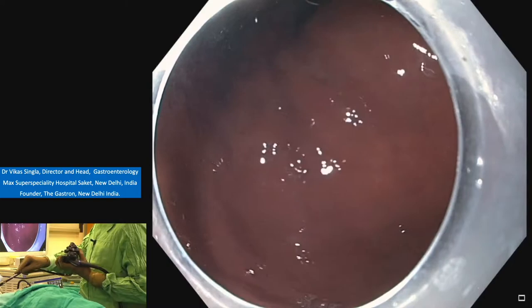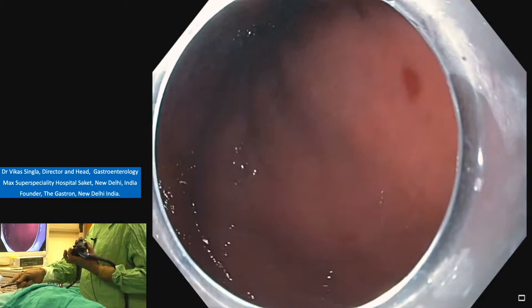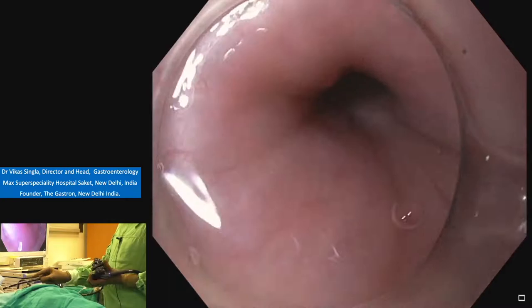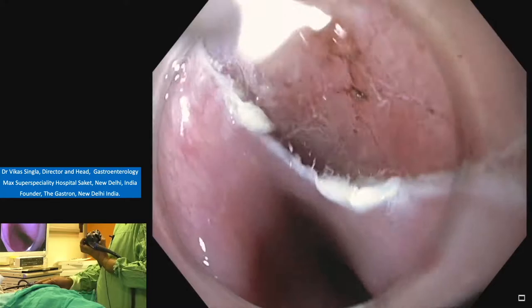So on the left side curve, we can see some bluish discoloration. So it means that we have moved in the right direction toward the lesser curve, and it's around more than 2 cm. And we'll go back to the tunnel. Pull the scope back. So that's the entry site. So again, should be at 12 o'clock.